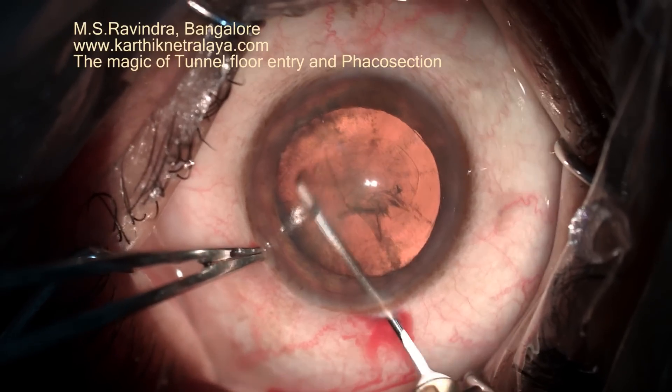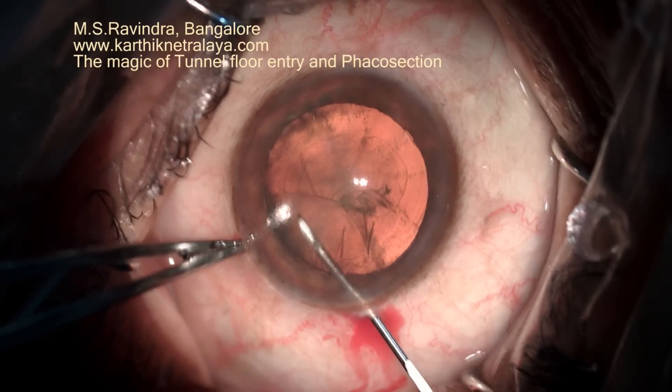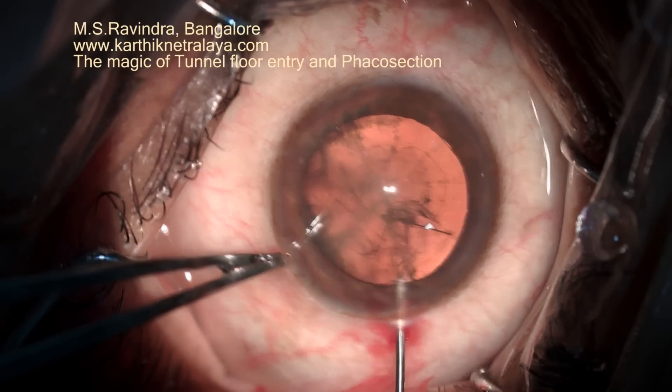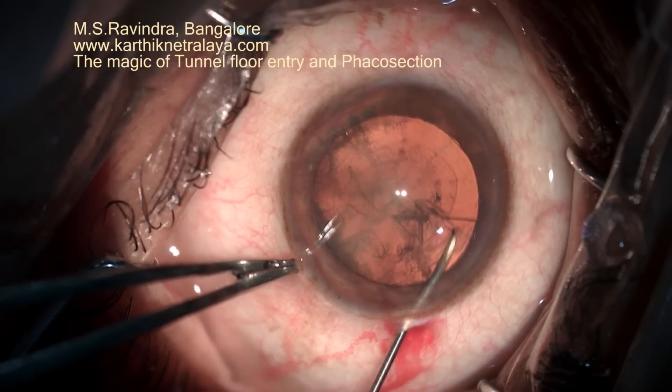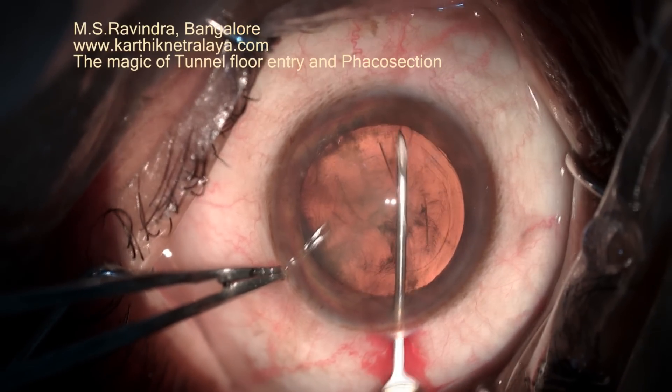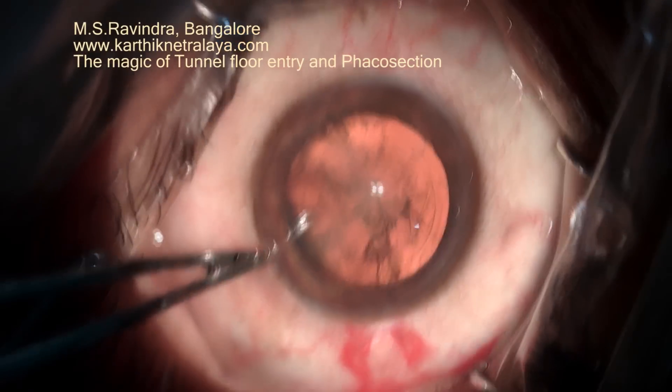Rhexis is made and completed, and the anterior chamber remains deep. There are no folds in the cornea to limit visualization, because the entry is in the limbal area and not through the anterior end of the tunnel.